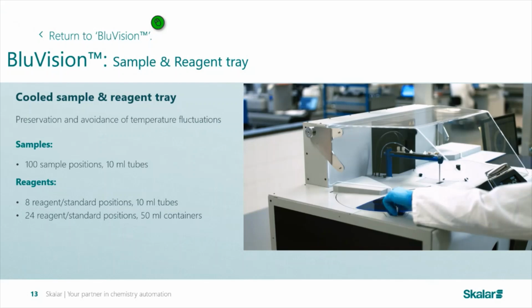That becomes very important, because you want your volatile compounds, such as ammonia, to stay in solution so it is there to be picked up for analysis. And if you think further into our analysis process, the ammonia that is there now has to be there 30 minutes from now when we come back for any, say, post-dilution work to avoid discrepancies in those results. As I said, in cooling both the samples and reagents, the onboard shelf life of the reagents is also preserved.